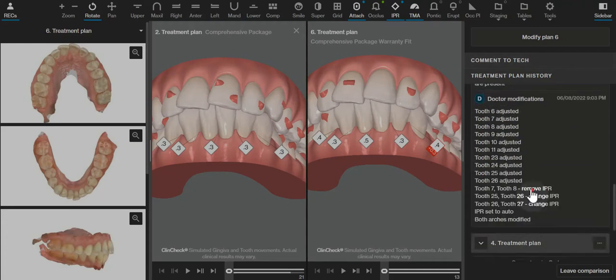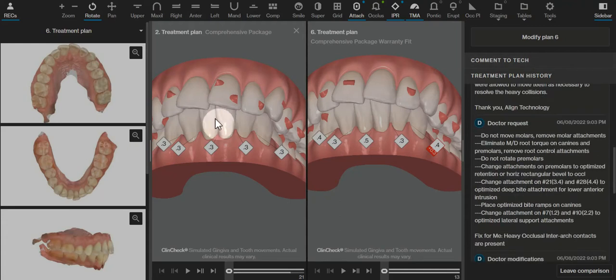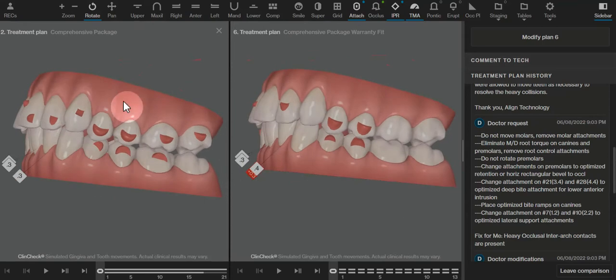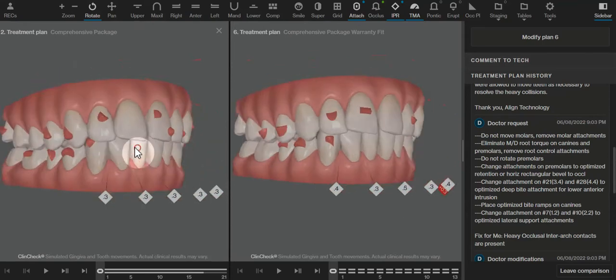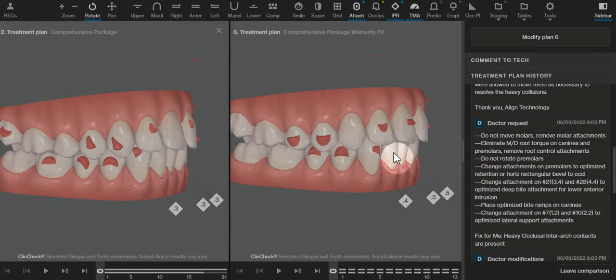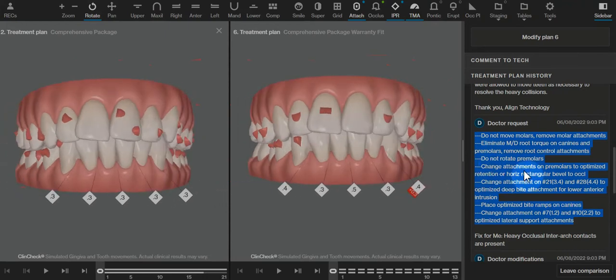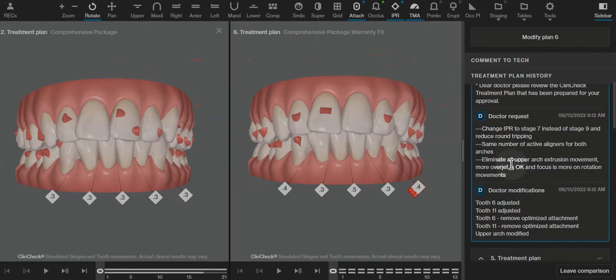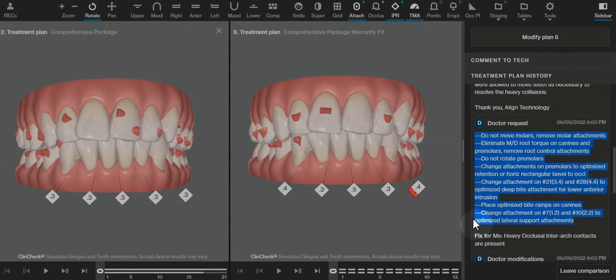This is a great malocclusion to treat where we have a similar amount of upper and lower crowding. So we can look at an initial ClinCheck that is not bound to go very well, and then one that is very predictable. You can see the comments that I made to the technicians to do most of the work to get to this much more predictable plan. But then I also use a little bit of the 3D controls, and here are some of my other final comments. So I'll leave those up.